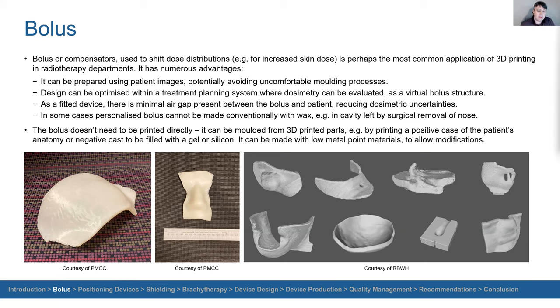3D printed bolus has numerous advantages. It can be prepared using patient images, which means that you can potentially eliminate some physical molding processes that might exist in a department that might use wax or plaster or thermoplastic on the patient. The design can be optimized within a treatment planning system so that you can basically design to improve the dosimetry of the treatment using virtual bolus structures within the planning system.